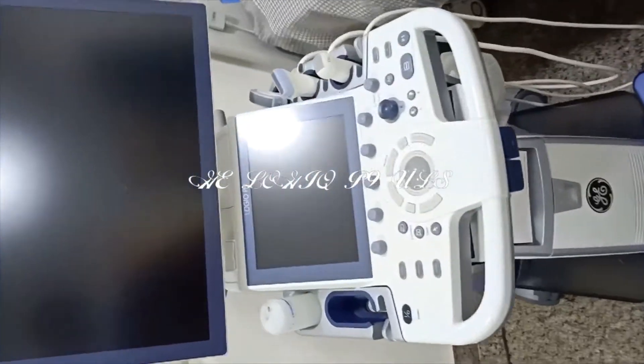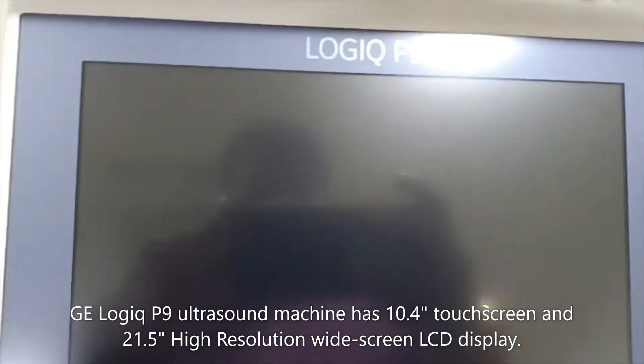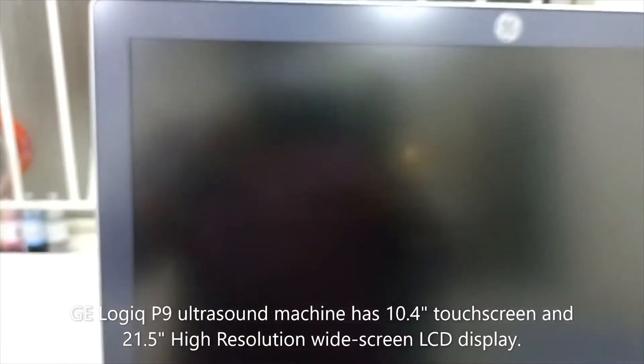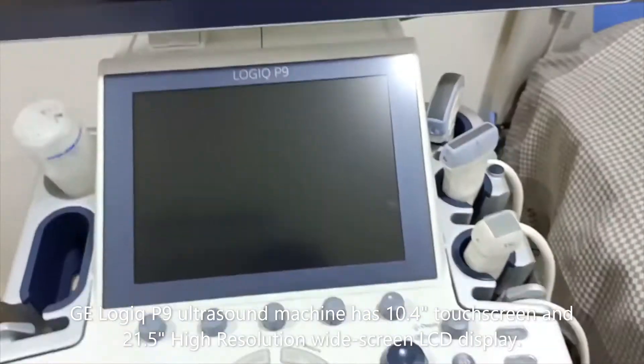Today we are looking at the Logic P9 ultrasound machine. In this machine you will get a touchscreen of 10.4 inches and a 21.5 inch high resolution widescreen LCD display.